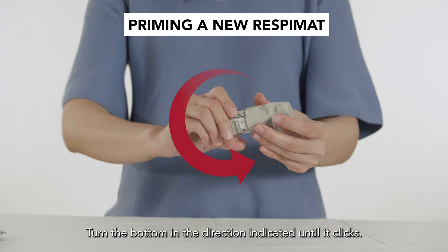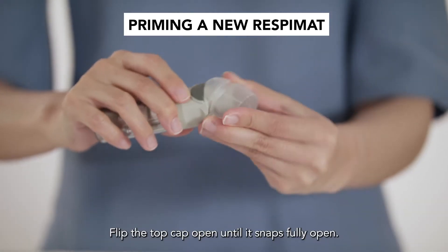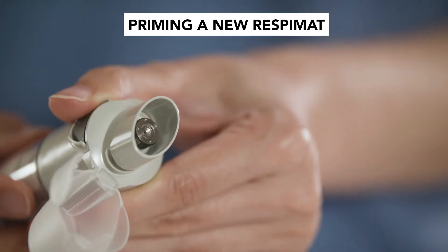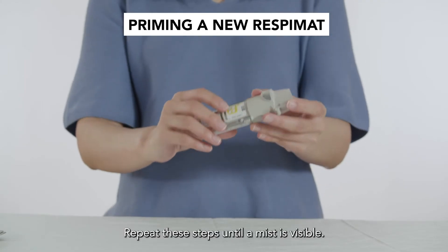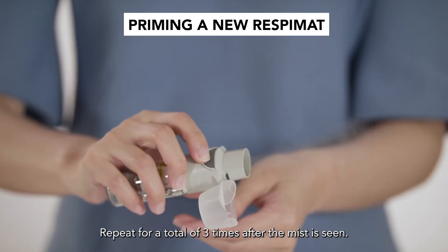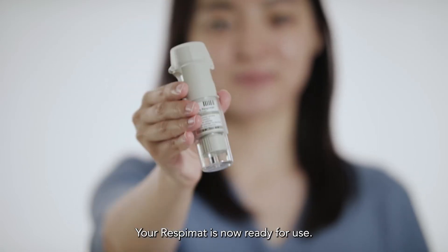Replace the clear base until it clicks into place. Turn the bottom in the direction indicated until it clicks. Flip the top cap open until it snaps fully open. Press the grey release button. Replace the top cap. Repeat these steps until a mist is visible, then repeat for a total of 3 times after the mist is seen. Your respimat is now ready for use.